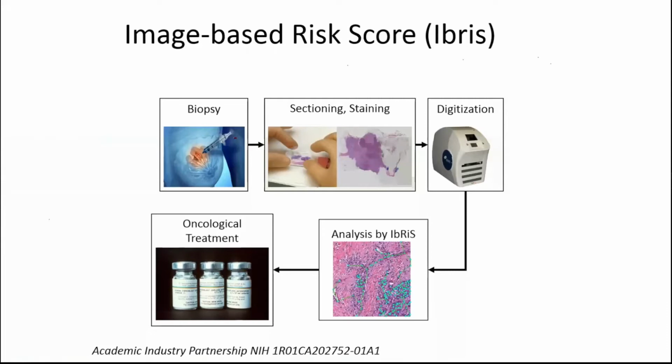And the reason I got really excited about this concept was because 13 or 14 years ago, when I first started working in computational pathology, or application of machine learning to digital pathology images, I started to focus on problems that were very near and dear to pathologists. So problems around disease detection and grading, right? Pathologists try to grade the severity of the disease, and they typically tend to have very fixed lexicons on how you do grading of a variety of cancers, be it breast or prostate cancer. And so that's what a lot of my early work was on.